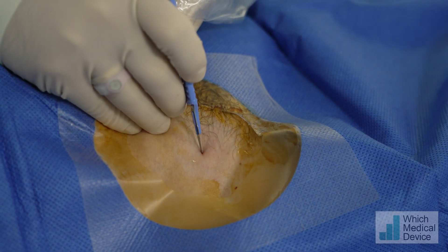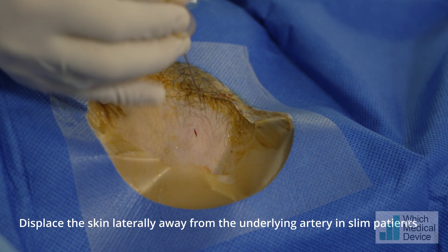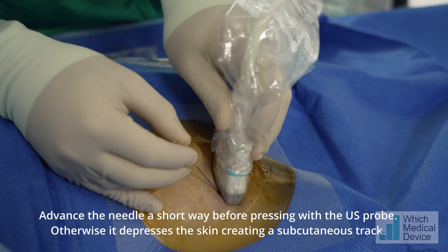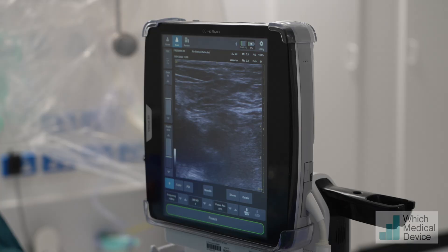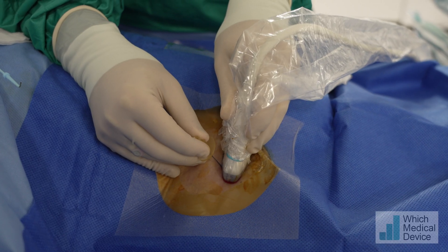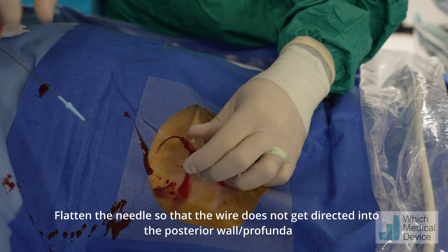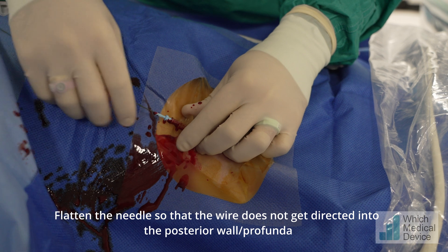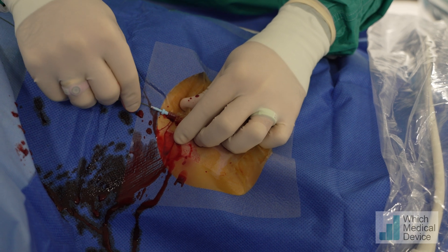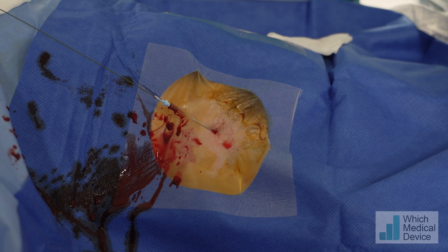It shouldn't be sharp - is that okay? Are we happy with the wire, Amanda? Just flattening the needle down slightly. Advancing the wire very gently with two fingers - any resistance and we're going to stop and check. But it looks like it's gone very nicely; it's just flying down.